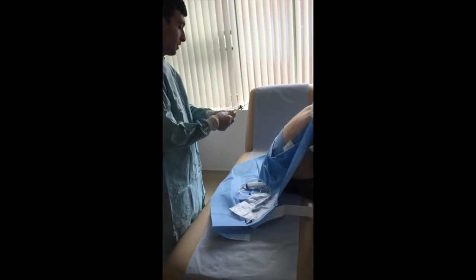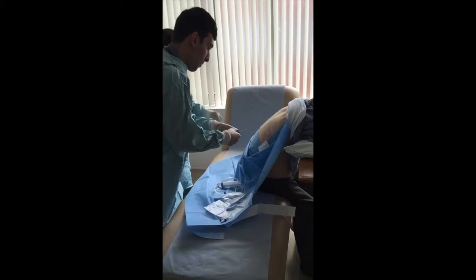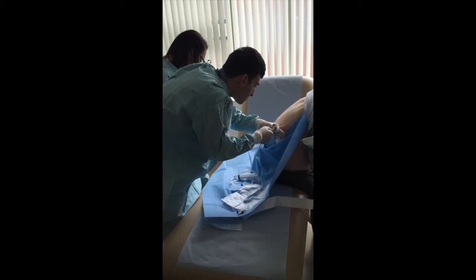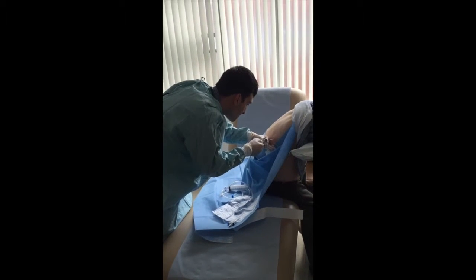Exactly the same. So just go around. We might need to get a new syringe. No, you don't need a new syringe. So again, find the point that you've gone into. Hand on the wall there, just to anchor that down.